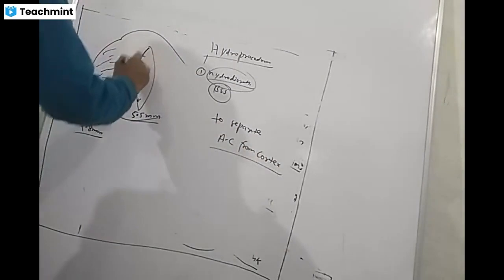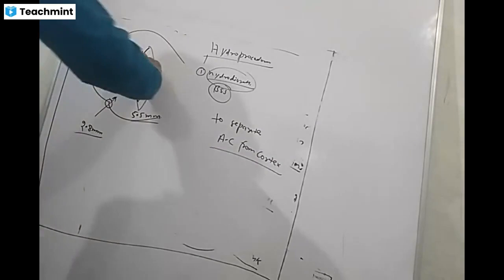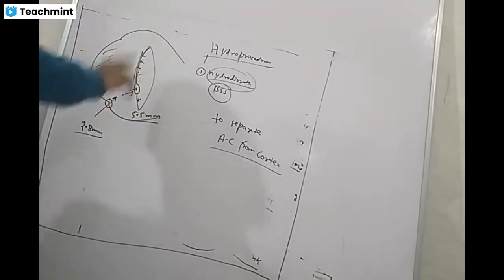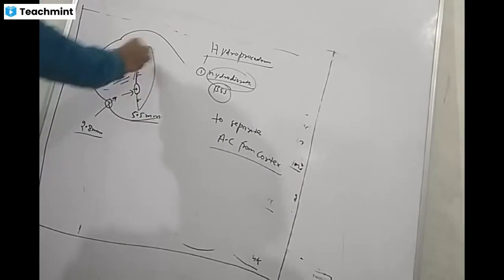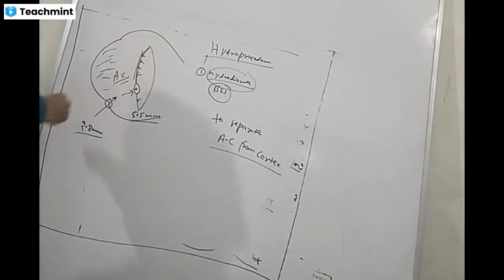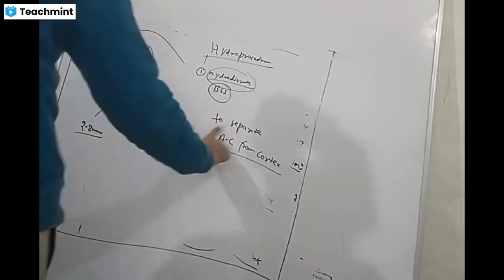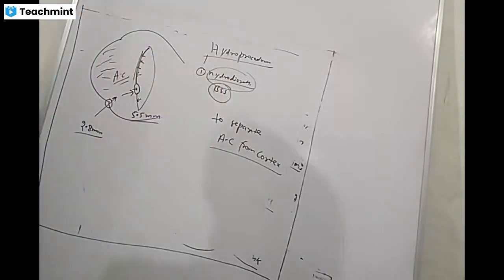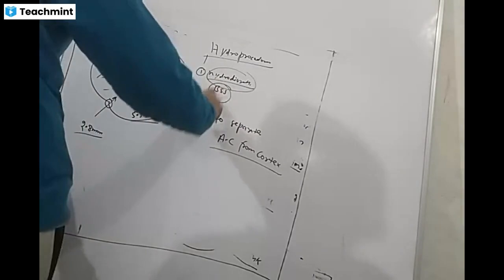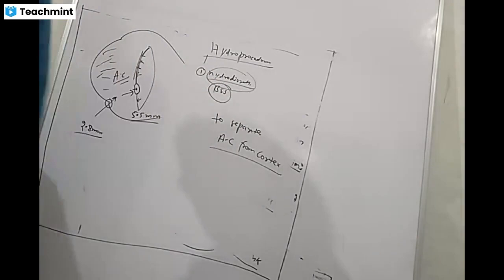With the help of the probe we will hit the cortex and make it macerated, pulverized, into small pieces, make it powder and bring it out. First we remove it, because it is attached to the capsule. So to separate this cortex from the anterior capsule, we inject balanced salt solution. Hydro means with the help of a watery substance; dissection means separation of the anterior capsule and cortex.